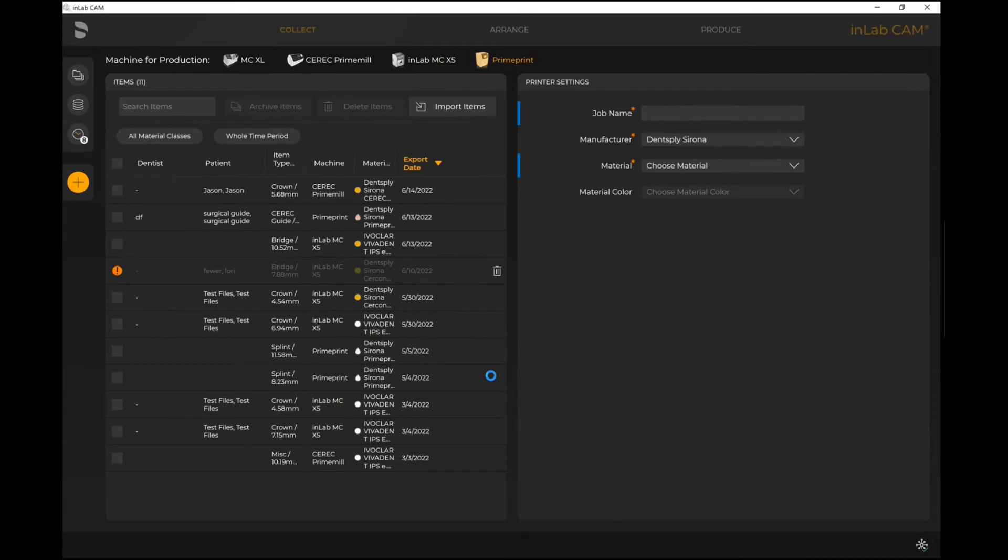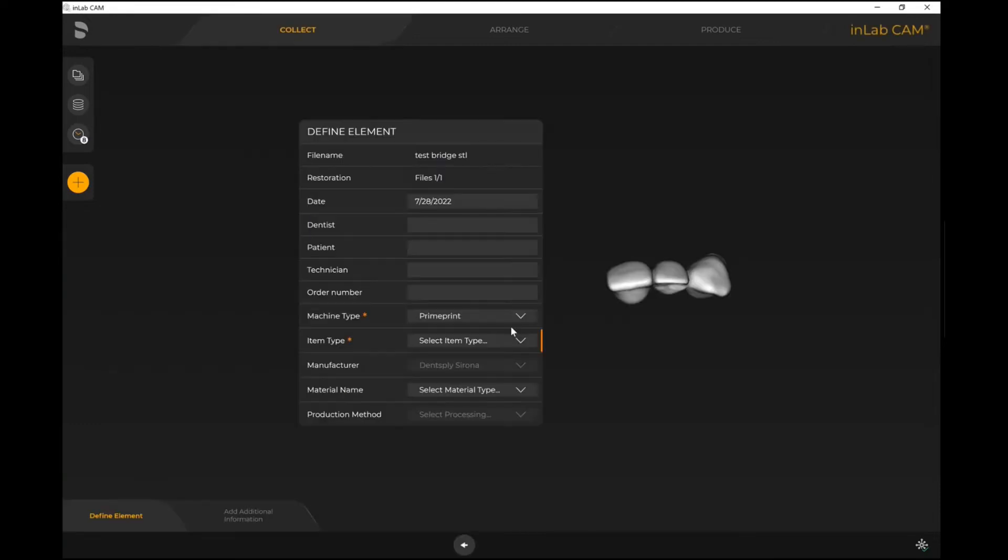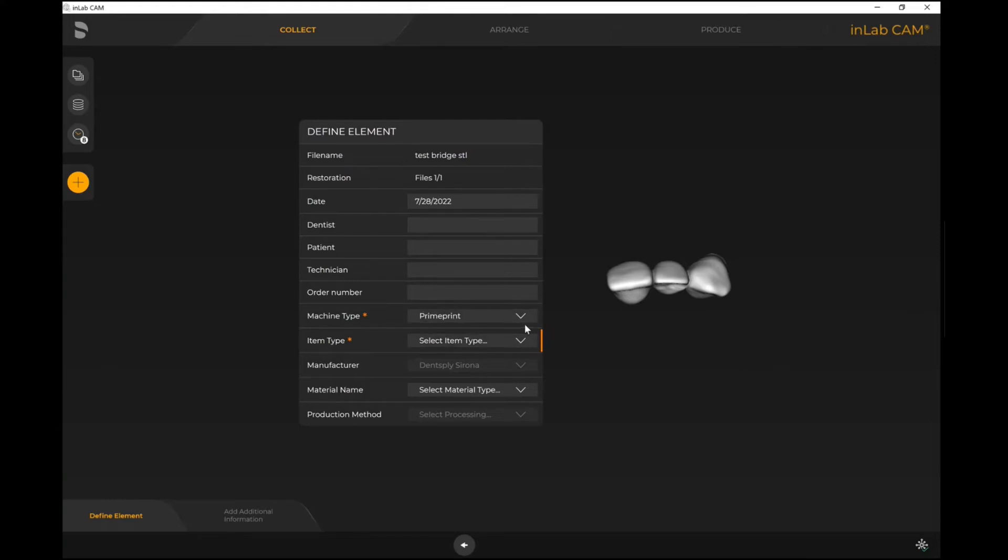I have to identify a couple key details for the actual software to proceed forward. I'm able to fill in anything here that I wish to. If I have a specific dentist or patient name I'd like to put, I can. However, the most important aspects here are the items with the asterisk.